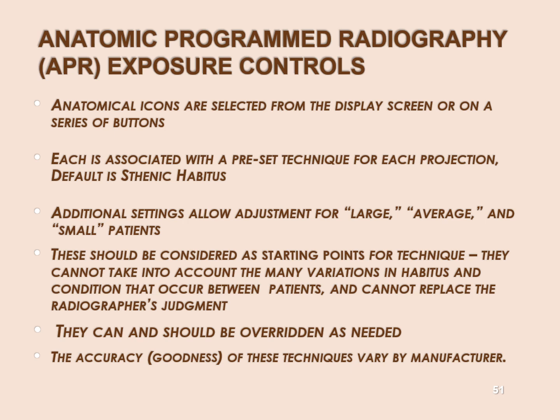So we are blessed in the digital age that with the software for the control panel, you can tell it what body part, what projection, PA chest. Sthenic habitus is the default.